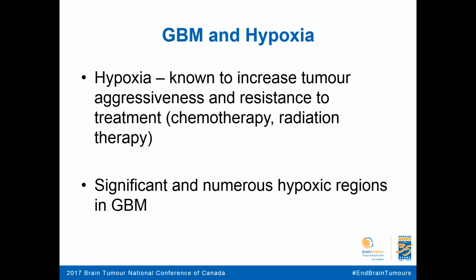So I explained a little bit about why hypoxia is bad. So how can this help us? If I can have a map of the tumor before radiation or before surgery, I know this part of the tumor is more hypoxic. I know that part of the tumor is going to be more resistant to treatment. So if we are doing any surgery for any gliomas, if it is possible to be more aggressive towards that part, that would be a good thing.